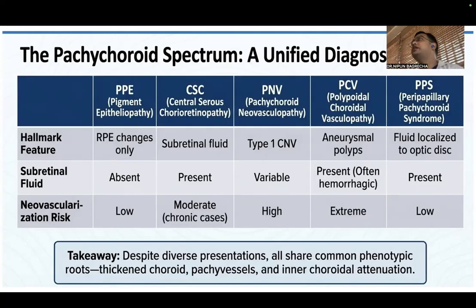The RPE has started to change because of the overload compression of the Sattler's layer. The RPE pigment epitheliopathy changes have started to come, so we will see only the hyperreflectivity on the PPE. In further slides, I will show you the OCT picture also.